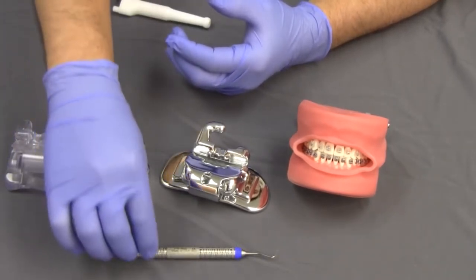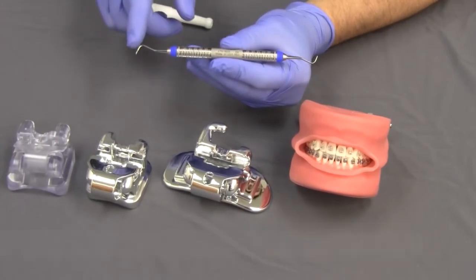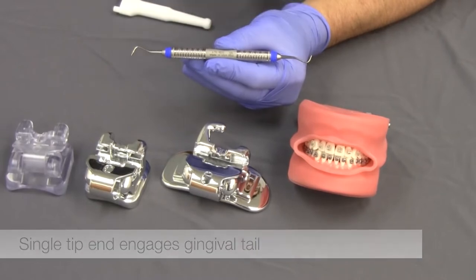Whether you are working with Empower clear, metal, or molars, one double-ended instrument works with all of them. The double prong tip of the instrument is used when engaging the facial hole. The single tip end engages the gingival tail of the clip for both Empower clear and metal.